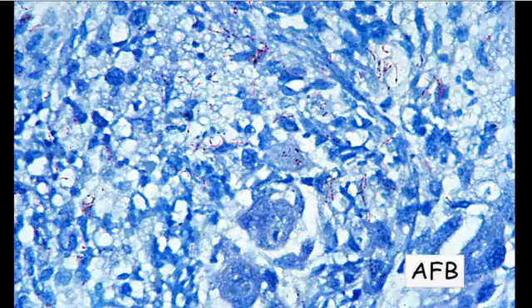And you can actually see the CMV infected cells down below and the macrophages here. So again, just because you find one pathogen doesn't mean you're off the hook. You have to look for multiple. That's a different kind of red snapper.